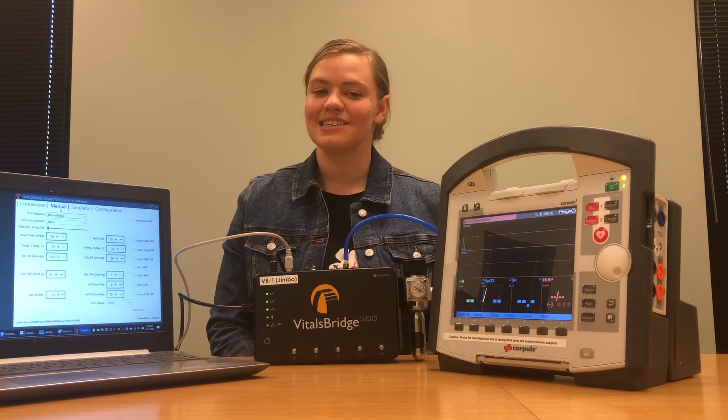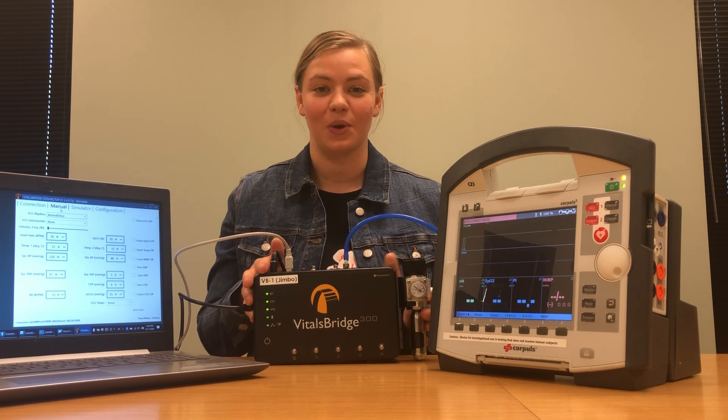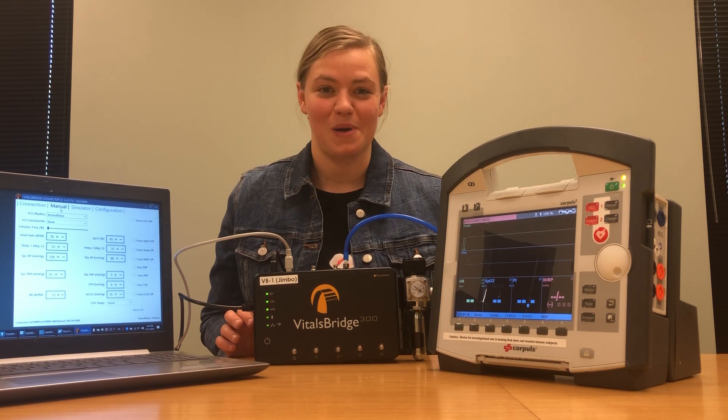Hi, my name is Haley and today I'm going to be showing you how to connect your VitalsBridge 300 mainstream unit to a Core Pulse patient monitor.